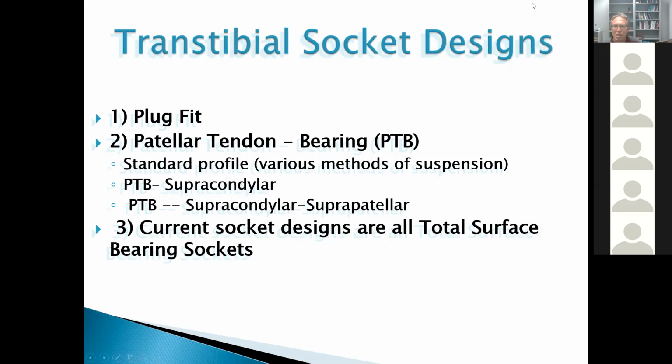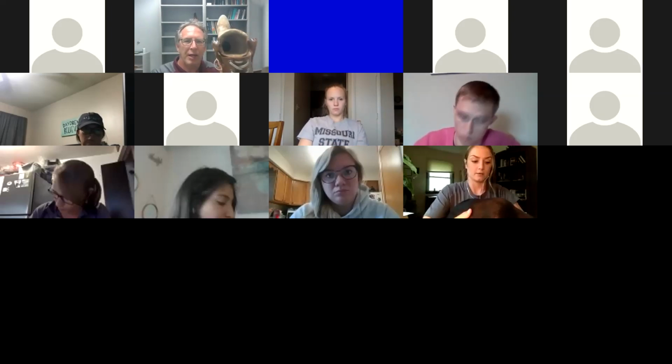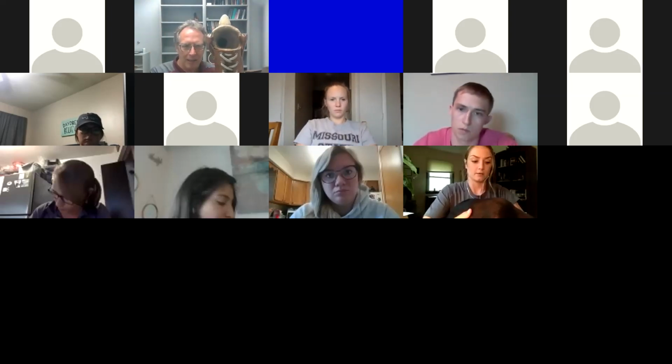So I'm going to unshare for a minute and show you something cool. Okay, so if you look at the inside of this very cool historic specimen of this rather ancient prosthesis, this is called a plug fit.